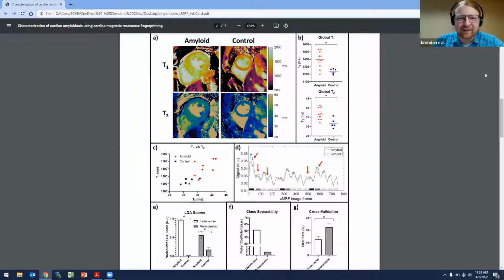Yeah, this has come up in our discussions. So we are concerned about pulse triggering and that we may not be capturing the T1 and T2 values at the same phase due to this, because there's always a different delay when you look at the pulse triggering. We would prefer to use ECG triggering. However, one thing in this population is that we've noticed there seems to be a lower voltage coming from the ECG signal. So we may want to look at some ECG-free techniques that can capture data throughout the cardiac cycle, or some improvements in the ECG triggering itself.